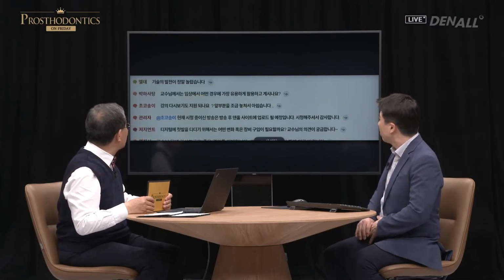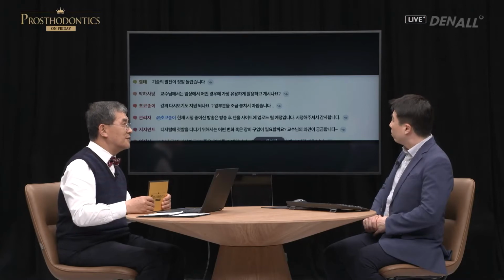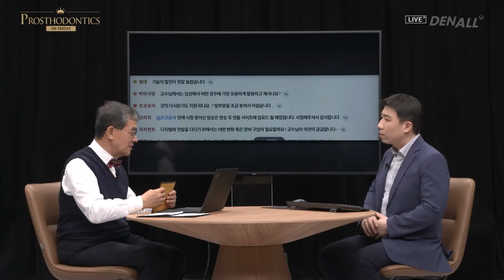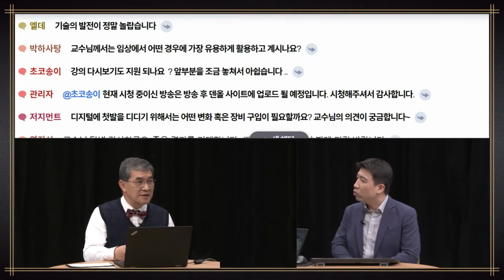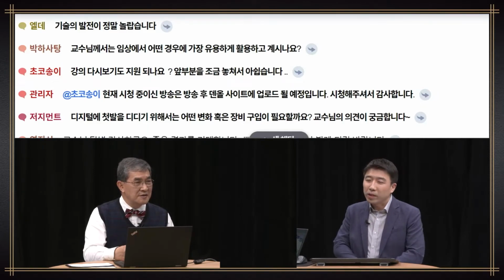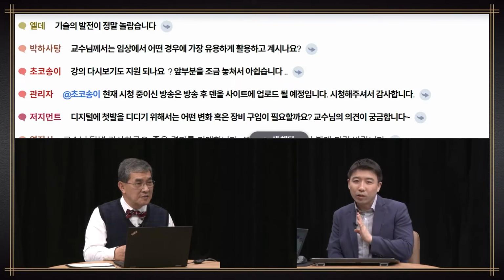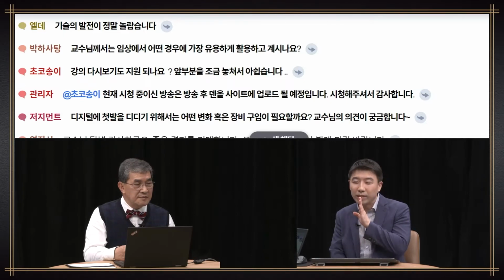In your opinion, clinically speaking, where is it most useful at present? I can think of 2 or 3 answers. I use it for 2 or 3 purposes, as mentioned, in the anterior area, in aligning the facial midline and dental midline.